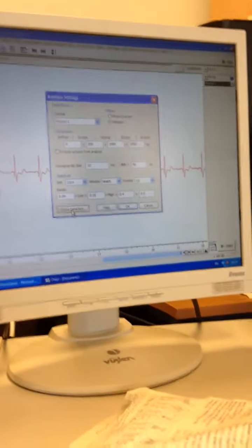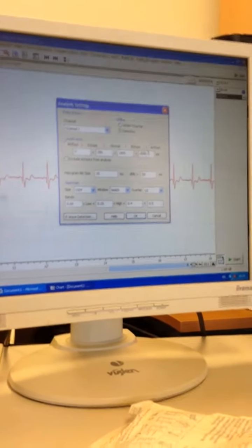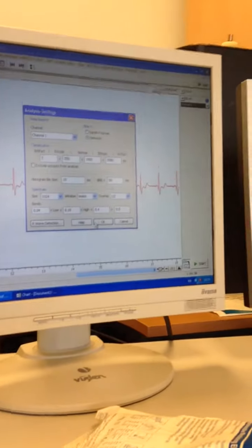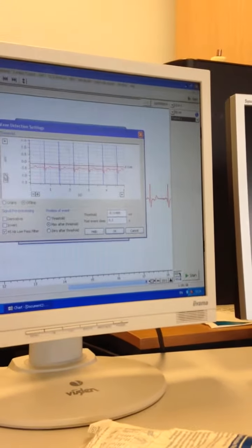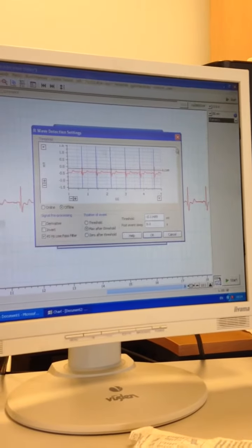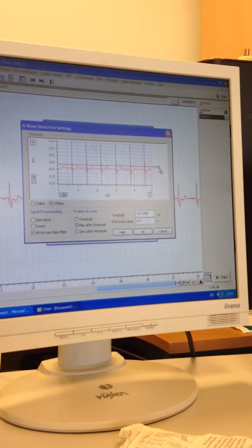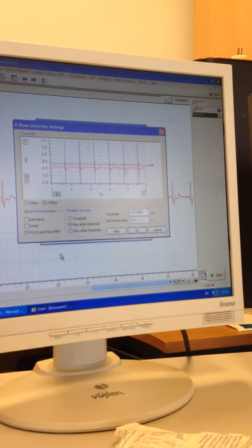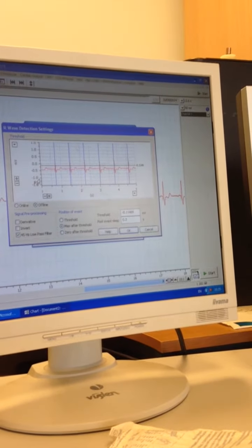So to then consider, you could click this R wave detection. All of this, pretty much keep it the same. These are the normal values. R wave detection. See, it's usually between this range, minus 0.1149, but between that and the negative equivalent.